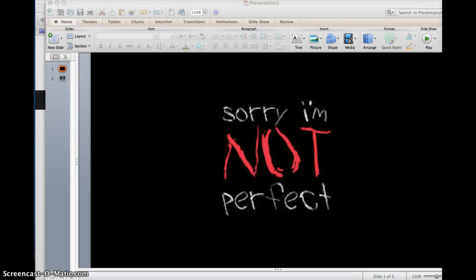So this little video is created as a result of today's class where there was some confusion in regards to the x-ray that was given in the case of the pneumothorax, more specifically the tension pneumo. So let me start off by saying, sorry, I'm not perfect. I've never said I was, and mistakes can occur.